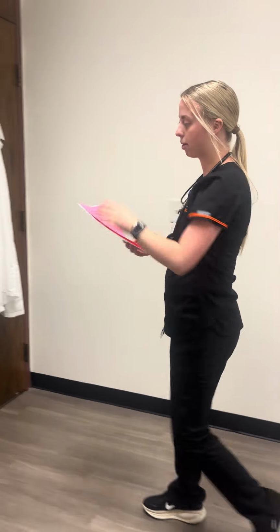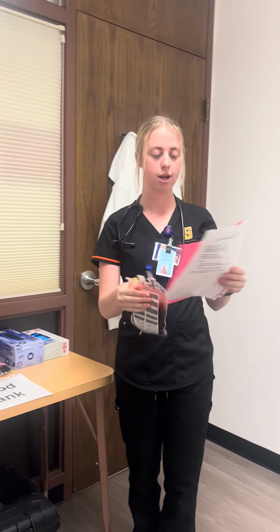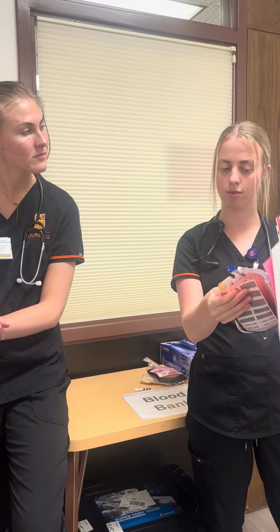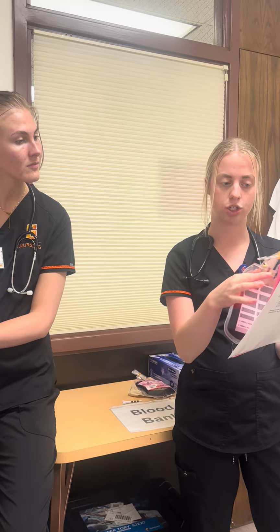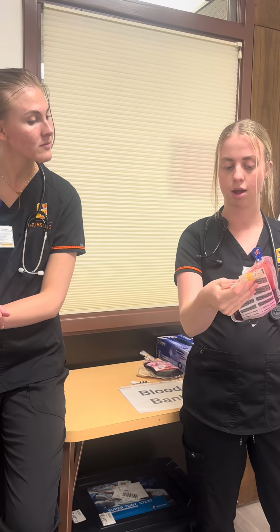So over here is my blood bank, and I'm gonna have a second nurse review with me. So I'm gonna grab the blood, and on here, I'll just have you review. It says we're giving O negative, O negative. I'm afraid to turn this upside down or it'll leak out. We're gonna check the unit number, make sure the unit number and the expire date always look good.